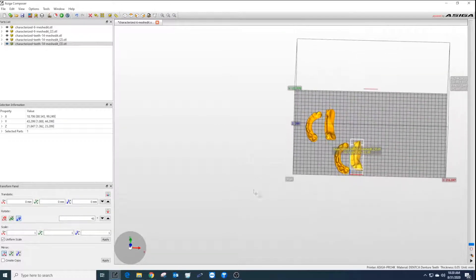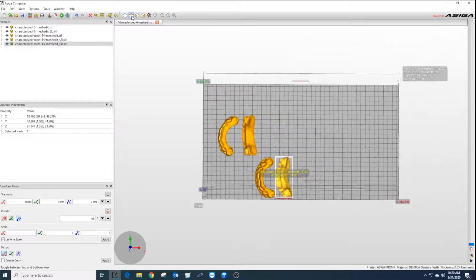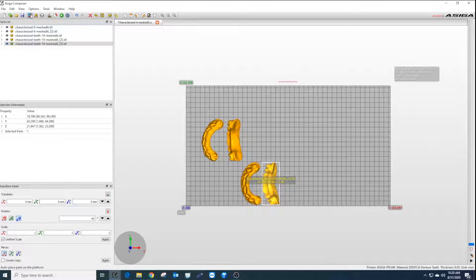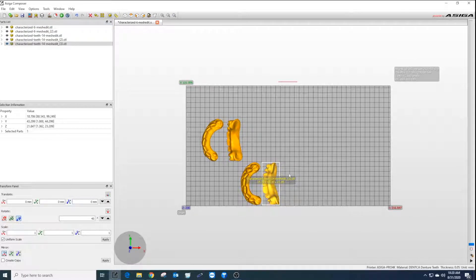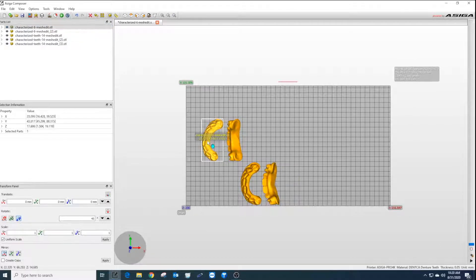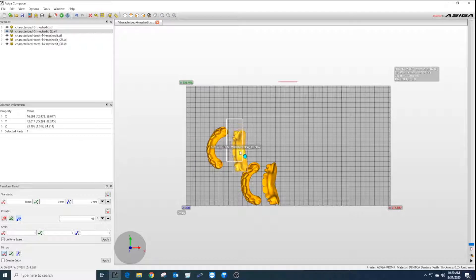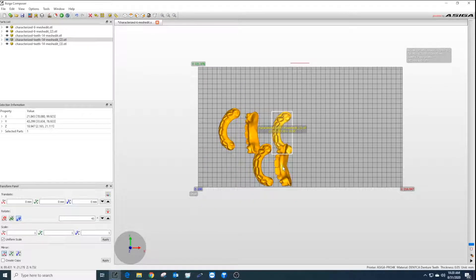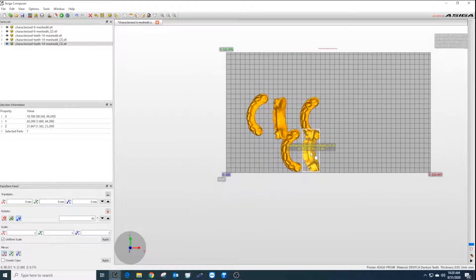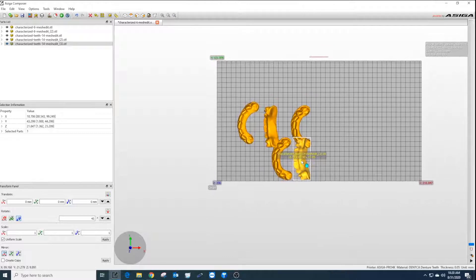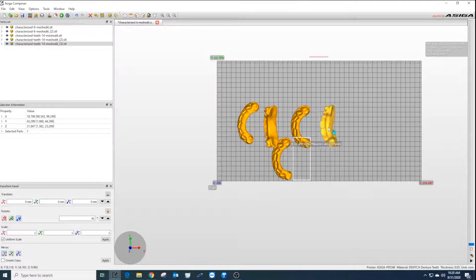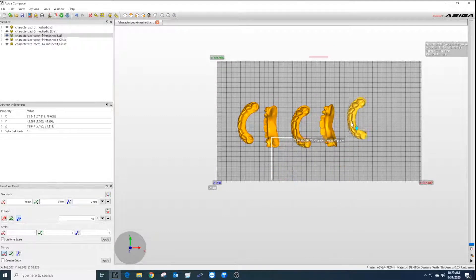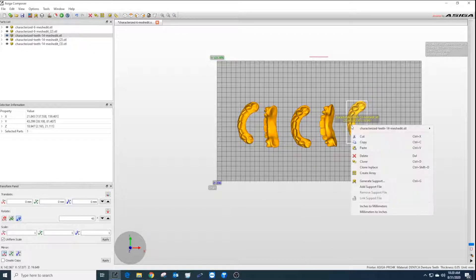When looking from a top point of view, it's helpful to make all the prints in line with each other and not overlapping on the build plate. To move the teeth, left-click on the object you wish to move, hold and move the teeth, let go when satisfied with the placement. If there are objects on the print plate that should not be, simply right-click and select delete.